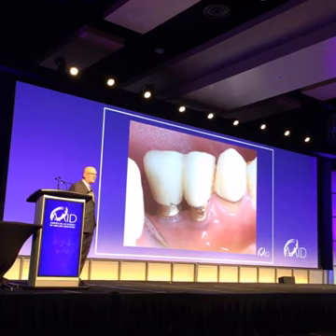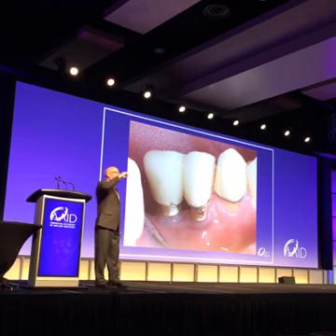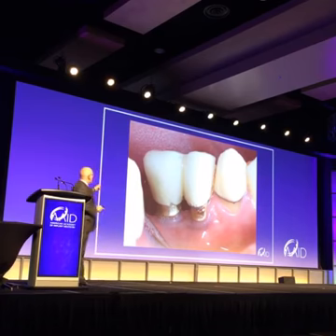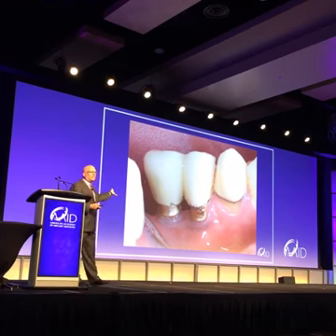There's a tissue. I mean, no one does this restoration, right? Look at that. My theory is they put it on backwards, cemented it, and didn't realize it until afterwards. I can't imagine a lab actually would get that. But look at the tissue tightness around that abutment. That's healthy, it's pink, it's beautiful. That's what we're shooting for. This is a maintainable implant.